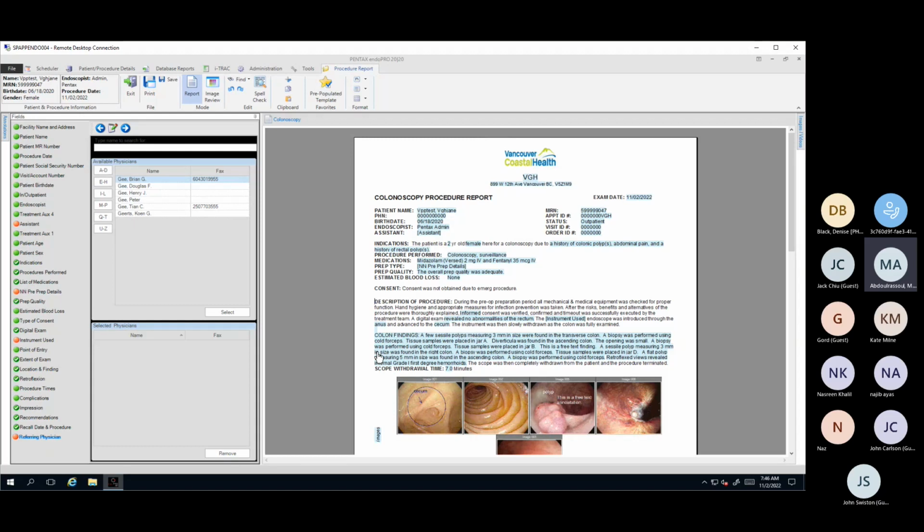A lot of this is wonderful feedback. A lot of the things that you guys are seeing and suggesting would need to come through Denise and the endoscopy group, that, hey, we've used EndoPRO for X amount of time. These are some of the changes we'd like to see.